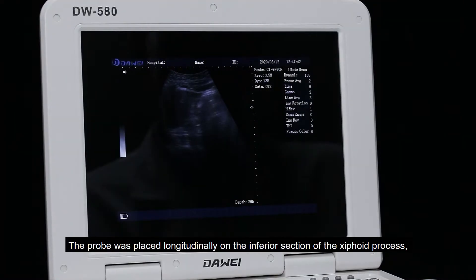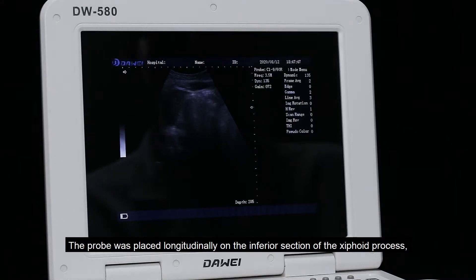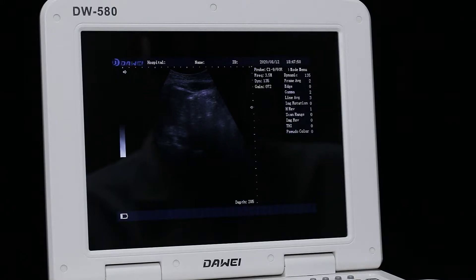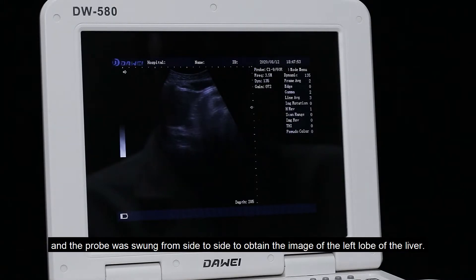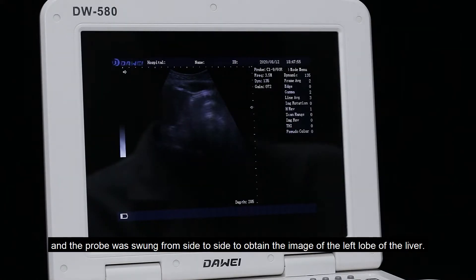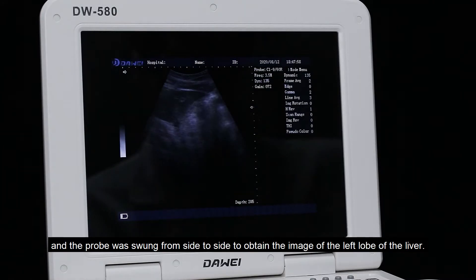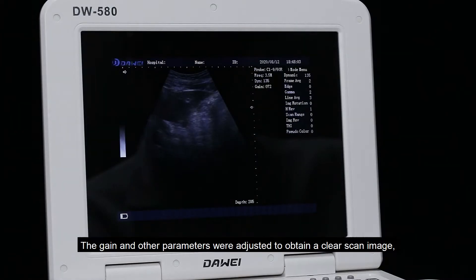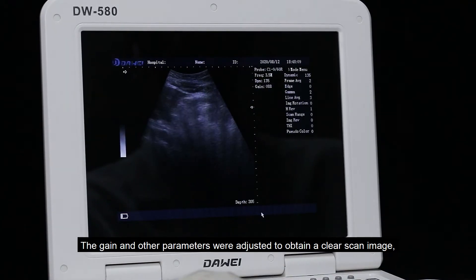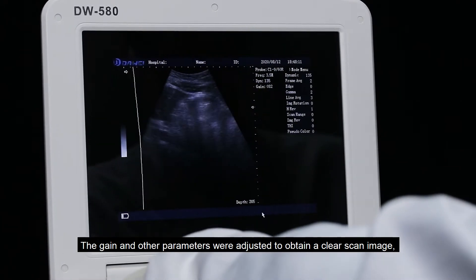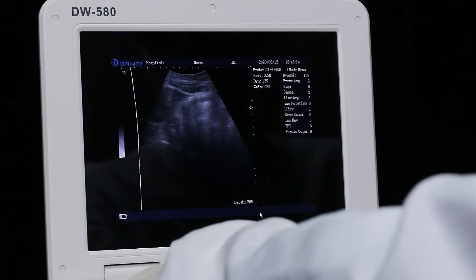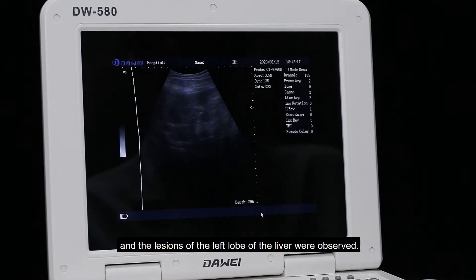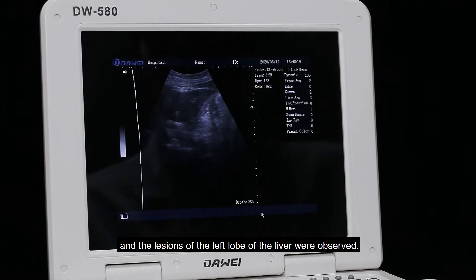The probe was placed longitudinally on the inferior section of the xiphoid process, and the probe was swung from side to side to obtain the image of the left lobe of the liver. The gain and other parameters were adjusted to obtain a clear scan image, and the length of the left lobe of the liver was observed.